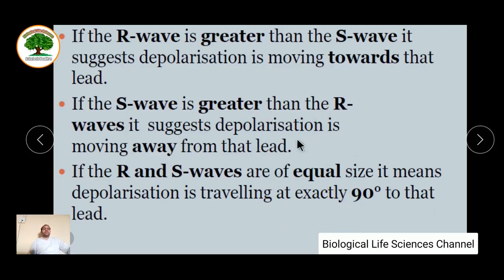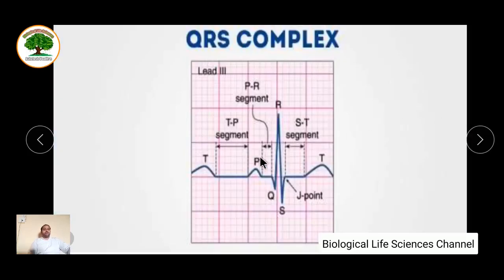Okay. So these are the calculations or readings taken by the different leads that result in the different graphs. These are the important segments taken by lead 3, which tells you the different segments, and the regularity of each interval is also calculated here.